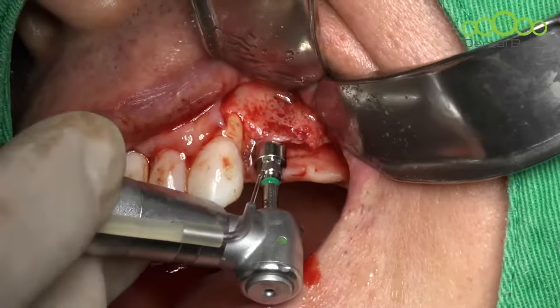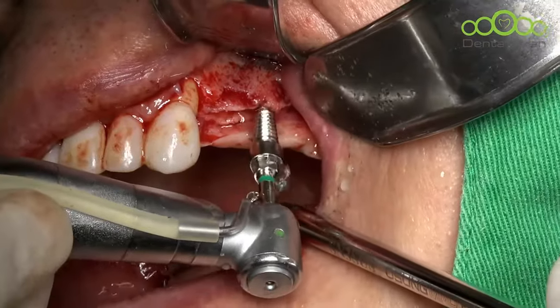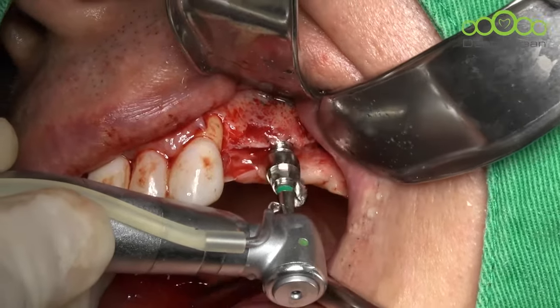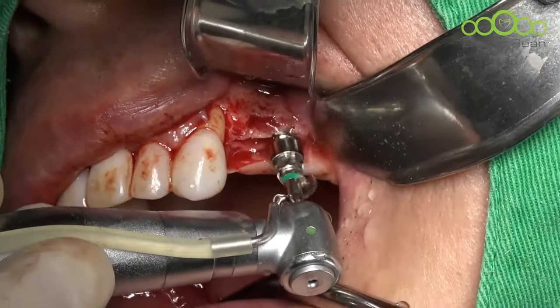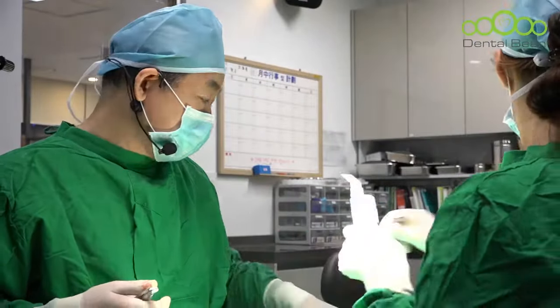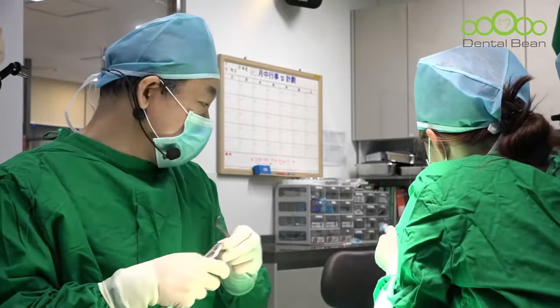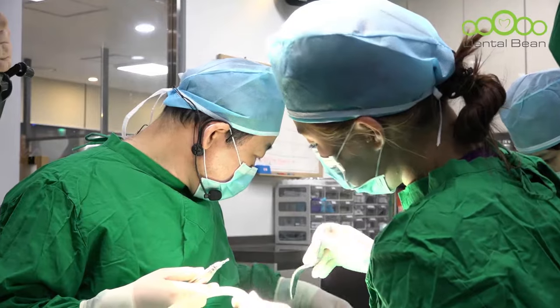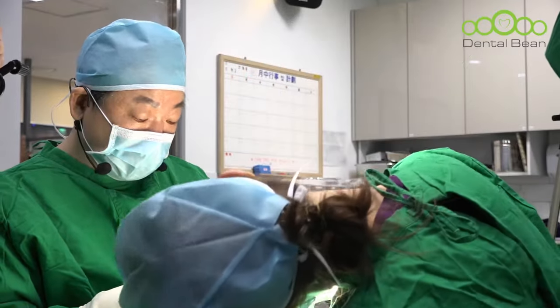And backward. Oh, it didn't work. Forward. Here. Backward. Looks close. Do you see? I'll prep the hole with a tapered drill. When it is the left side, better to use a long drill. 10 millimeter. Here. Okay, here. I'll use the extension.